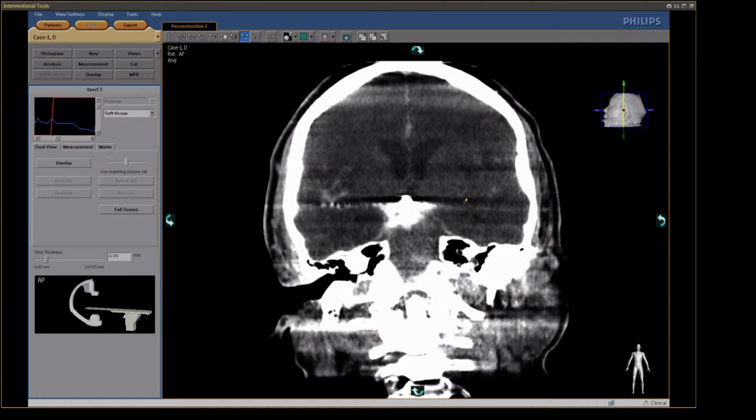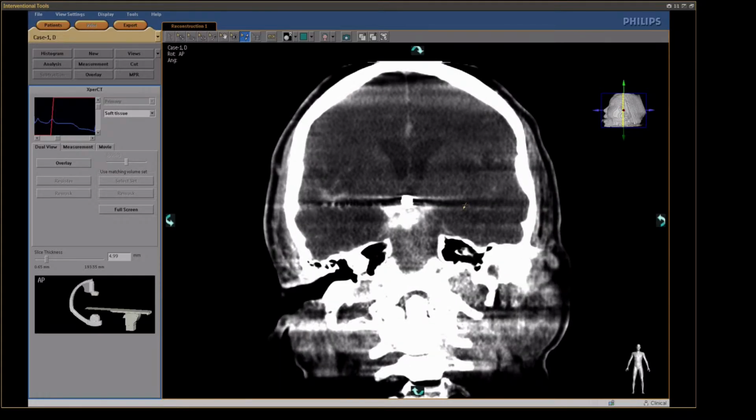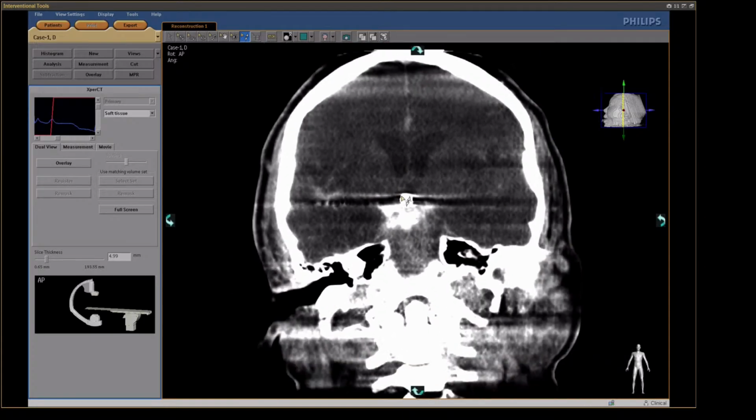Now we'll finish and patient will be in ICU for several days, maybe a day or two, because of the previous rupture. Usually those patients recover quicker. Let's see. We will repeat the CT tomorrow morning. And then after control CT, we will decide about the lumbar puncture.